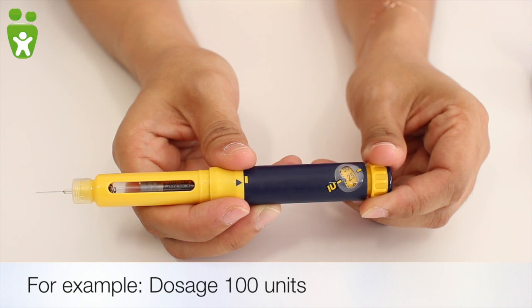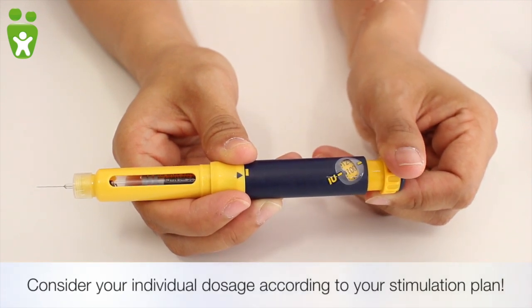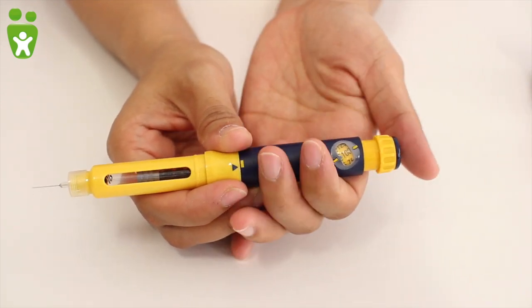In order to set the units, turn the button at the top until you reach the desired dosage, in this case 100. You should see the mark between the two yellow lines. Then the pen is ready.